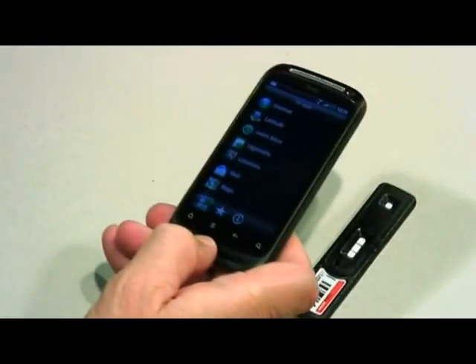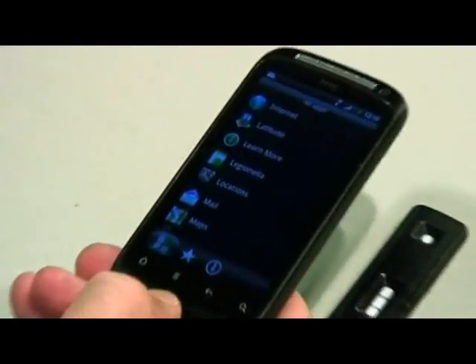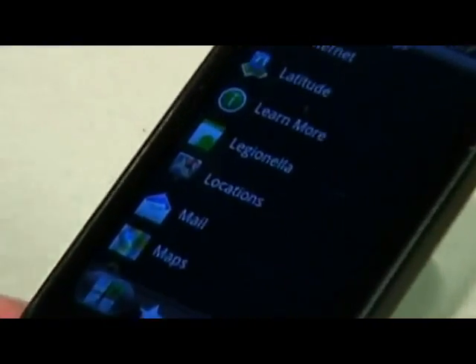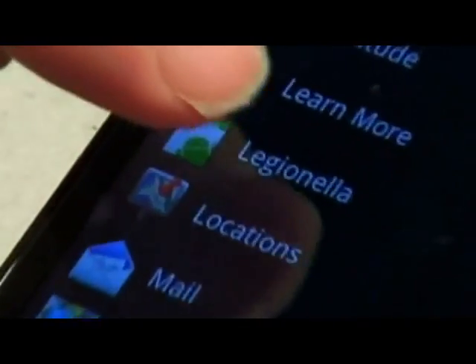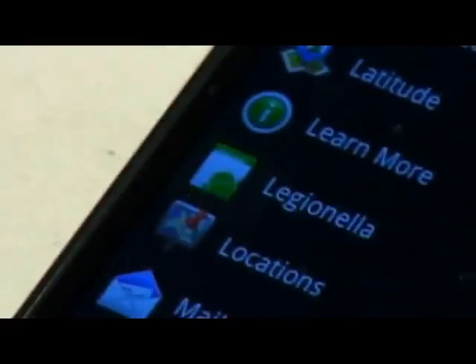Lateral flow tests are used in many applications, but without expensive dedicated readers, they provide only qualitative results. Through our innovative smartphone reader, we are revolutionizing the use of the lateral flow test.